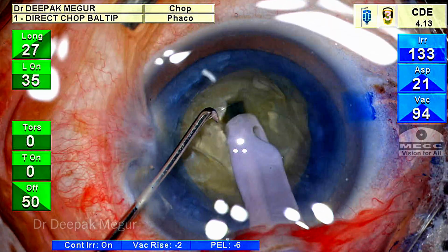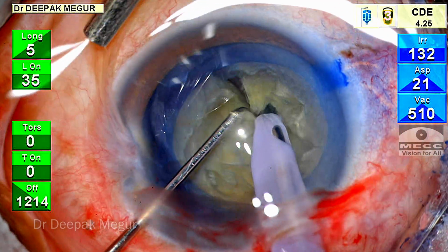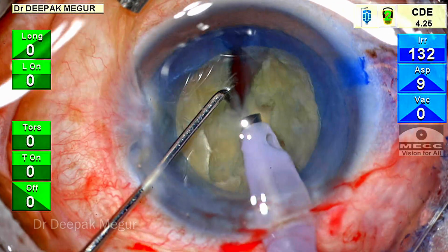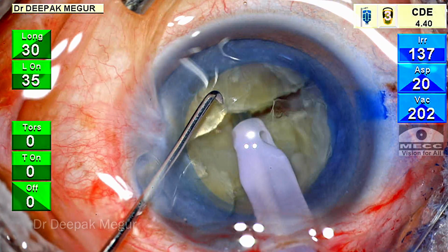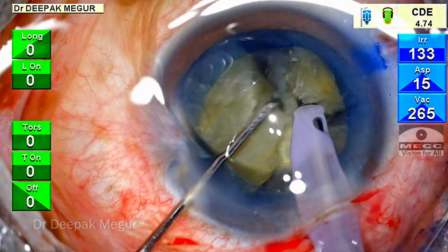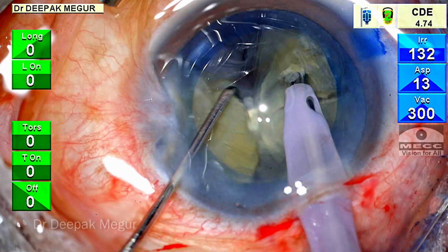The settings are changed to the longitudinal mode. The tip is buried into the substance of the nucleus. The vertical chopper goes down vertically, and then there are lateral separation maneuvers. The nucleus is slightly dense. The second chop is being performed, and because of the density of the nucleus, a couple of attempts of lateral separation are necessary to break the posterior plate.